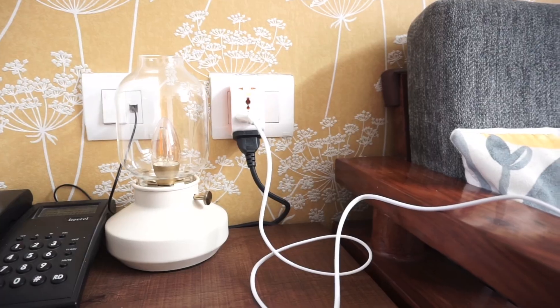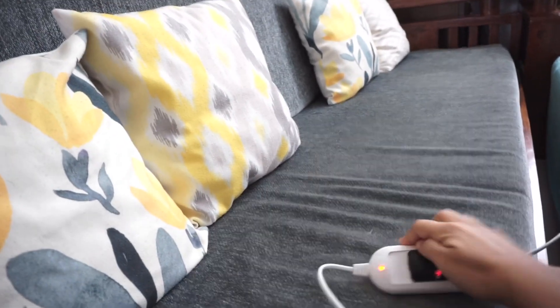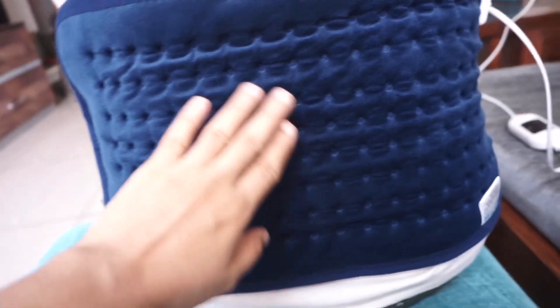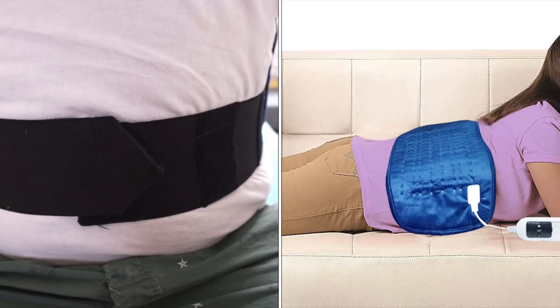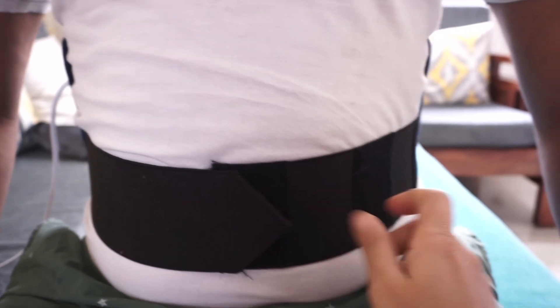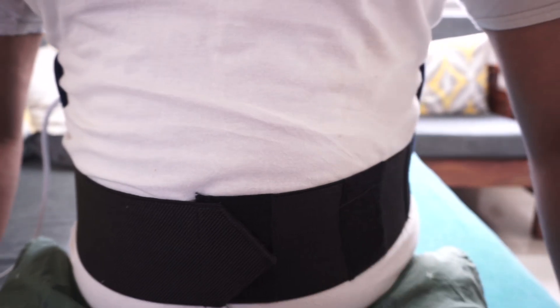If you have been working all day long and have back pain, it helps to get rid of your back pain. Just attach it to the electrical outlet, wrap it around your waist, and be either in a sitting position or make sure the heating pad points upwards while you are in a sleeping position. Make sure there's a space between the heating pad and your body. This is how you can get rid of persistent back pain — just apply for around 15 minutes and you are good to go.